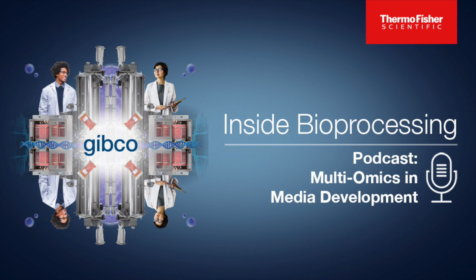And also for the downstream workflow for manufacturing, I think spec based methods also can perform quality control of our products, or many others, such as HCP analysis, to reduce the risk of our products, that kind of thing. So I will say omics can identify differentially expressed genes, proteins, metabolites, lipids, among different conditions. So it can be applied in each step of our bioprocessing development workflows.